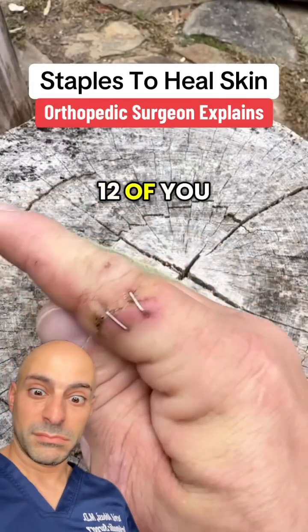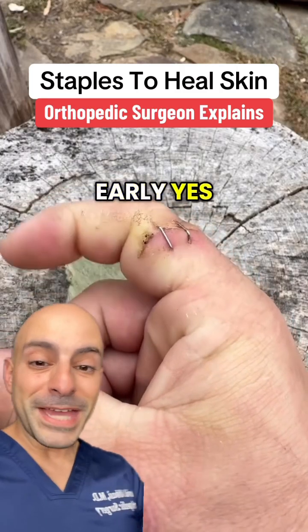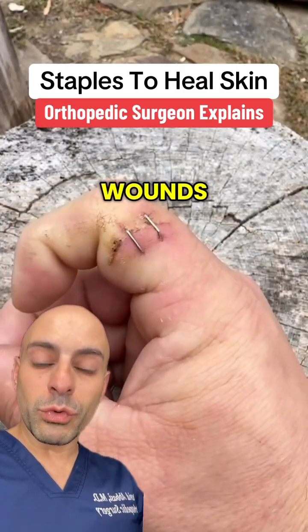Here it is, the moment that 12 of you have been waiting for. Let's pull these staples out. It's a bit early, but yes, we do actually use staples in surgery to close wounds.